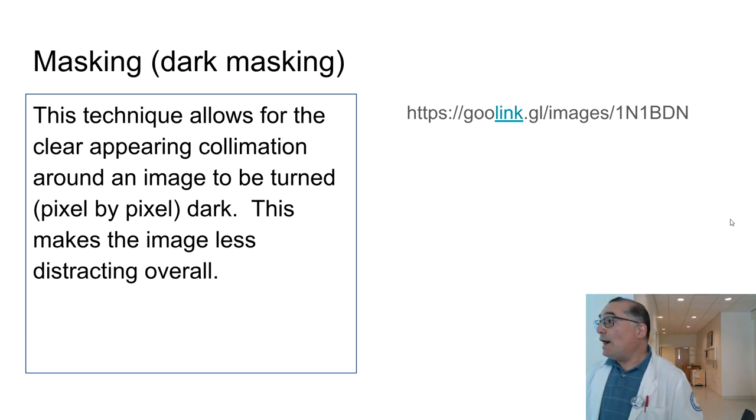By the way, that would be what type of processing that we discussed a week or two weeks ago? What domain does that come under? You guys remember? You said the two. The answer is the one you didn't say. So she said spatial and she said frequency. What's the one she didn't say? The intensity domain. Well, think about it. What is it doing? It's analyzing the intensity of the pixels, which are all pretty bright. I'm sure there's a range within that, right? And the computer says, turn those off. Make them black. And there you go.